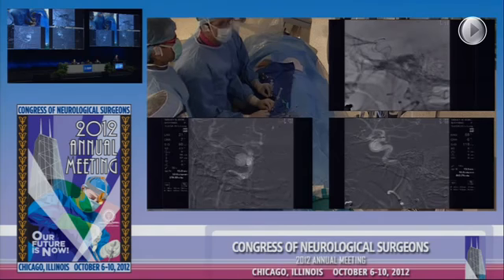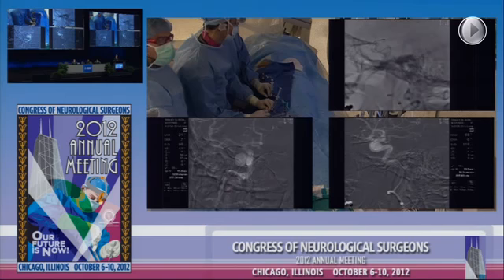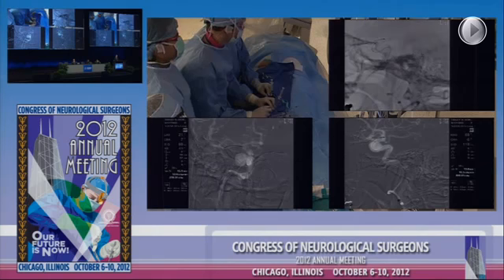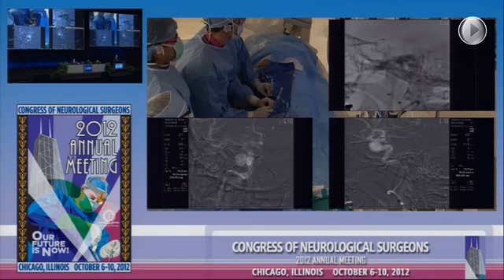Can you go on the native view, Paul? Yeah, he is. So the stent is open distal. I'm just pushing. So delivery is push-pull. You can kind of see how nicely it's opening it. We don't want this to windsock or herniate into the aneurysm.